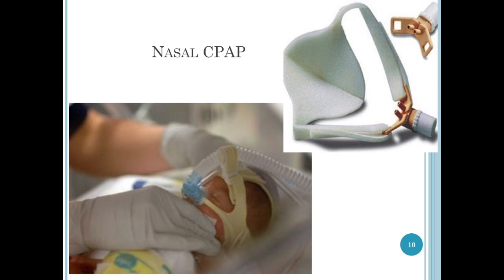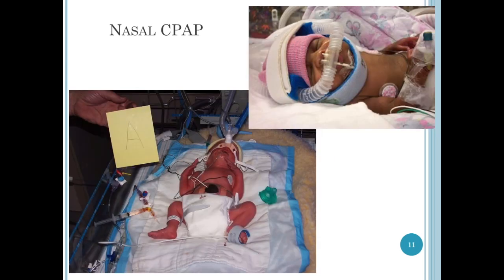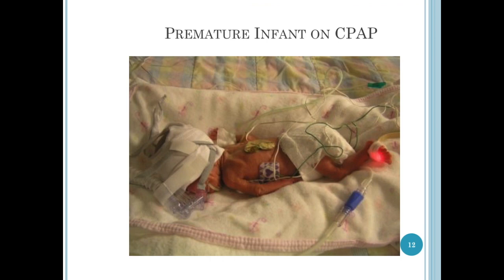And this is a very complicated looking child who's using a nasal CPAP. You can see how it consumes the whole head. And so we're switching over to that high flow nasal cannula. It doesn't mean that all kids will be on that, but if they can go without the CPAP, they'll be using the high-flow cannula. Here's another one with nasal CPAP. And look at this little one. This baby is probably about a 23 or 24 weeker and requires CPAP.